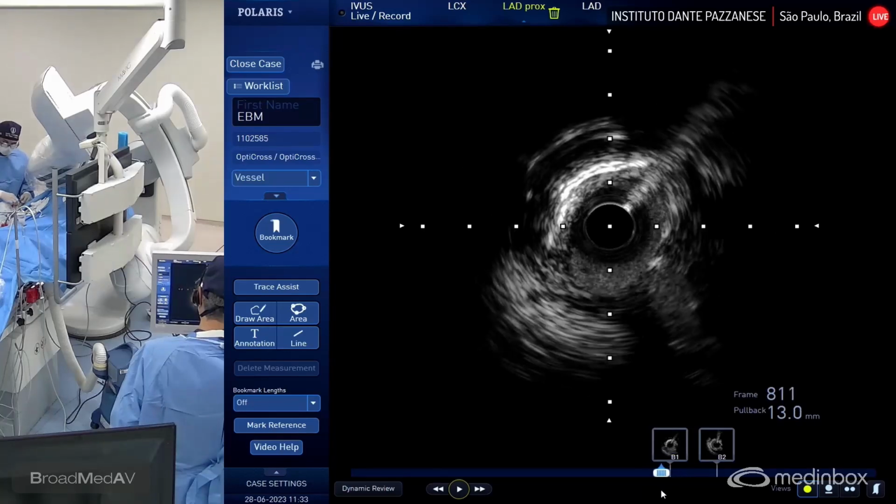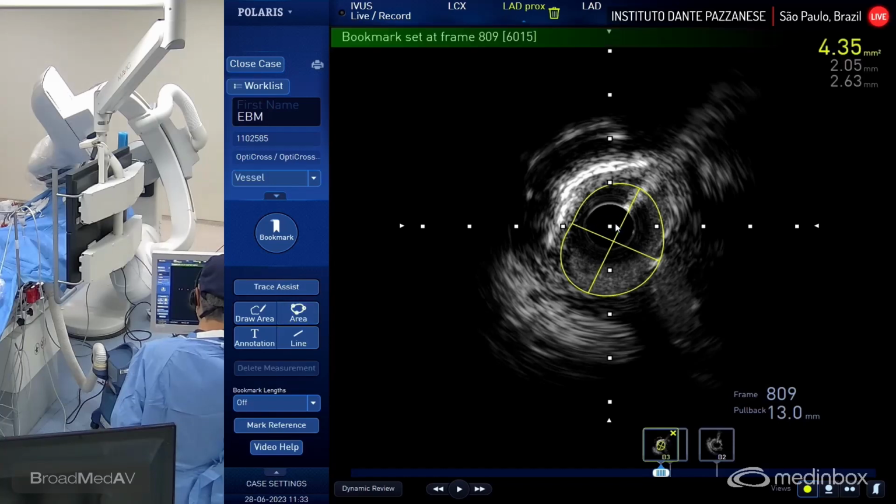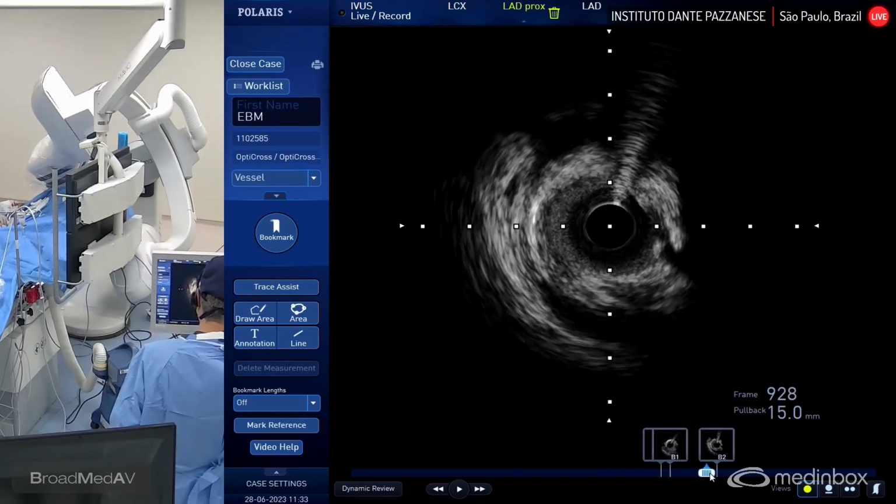And I have to say this is more disease than what appears by angio, right, Louis? Yeah, perfect. It's more severe than some of the measures we thought here. It's still above 4, but it's definitely more significant disease if you compare to the real vessel size.